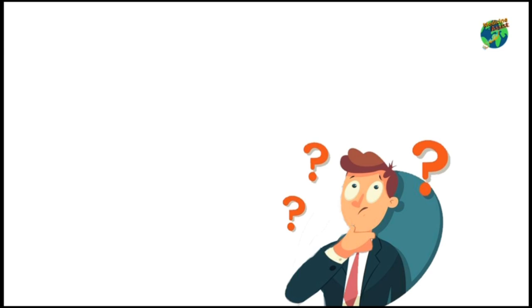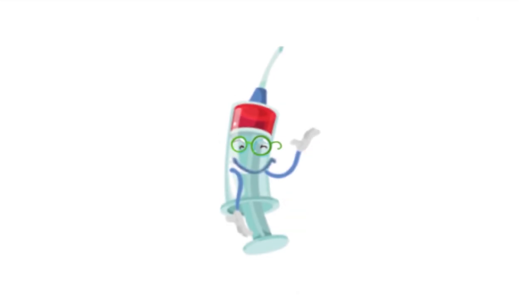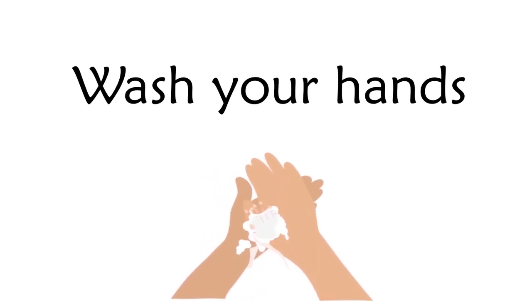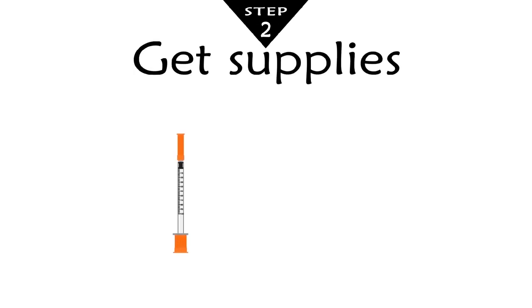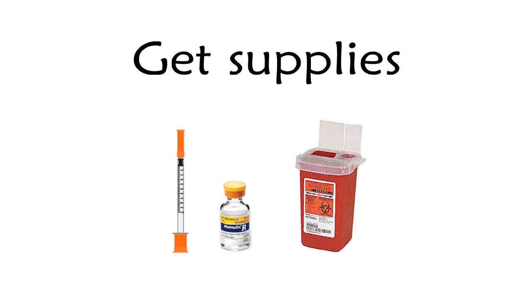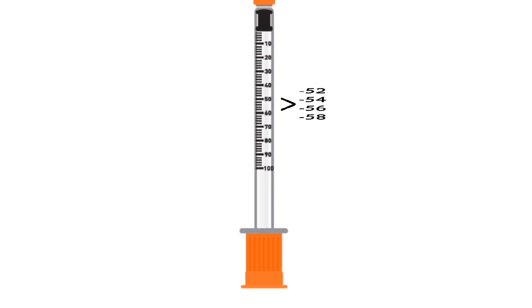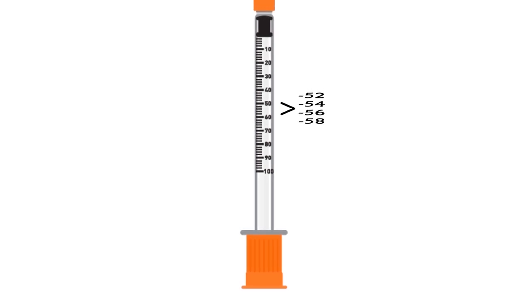It seemed to me that my dad injects his insulin in a different manner each time. There are standard steps that need to be followed. Let's begin by washing your hands. The supplies you will need: insulin syringe, insulin vial, and a sharps container. In the syringe, the lines help you to tell how much is in the syringe. On one type of syringe, each line may be two units. There are also syringes that have markers for each unit and each half unit.